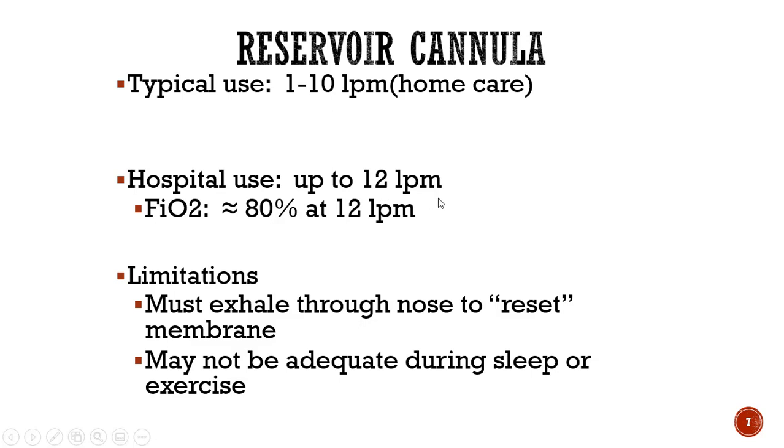If you're going to be on a 12-liter oximizer, you generally are going to have a patient on a high-flow nasal cannula blender. Where we use these instead is some hospice patients or palliative patients, patients that are really wanting to go home or motivated to go home. You can't obviously go home with a blender. So oximizers still definitely have a very relevant place.